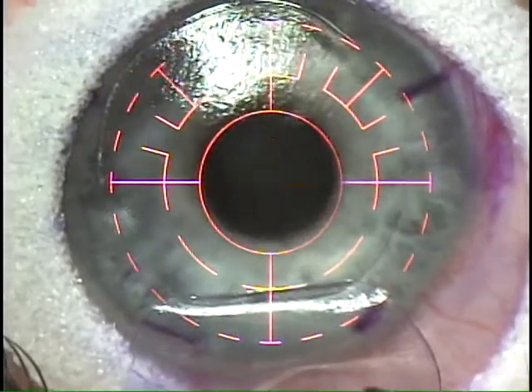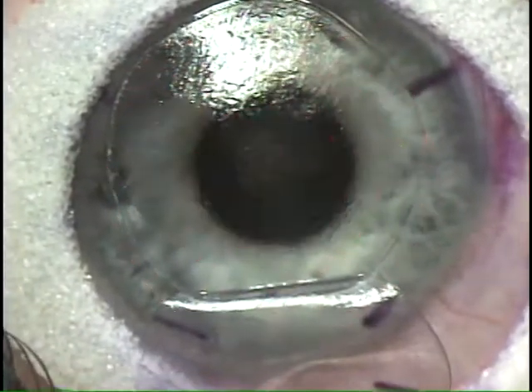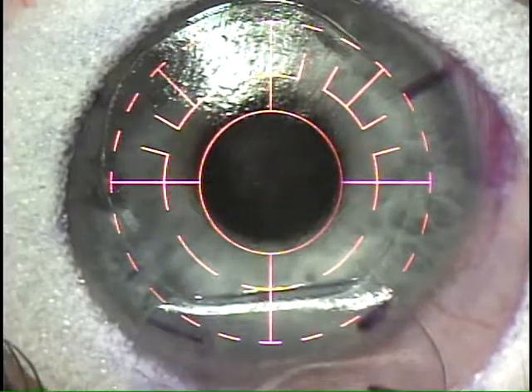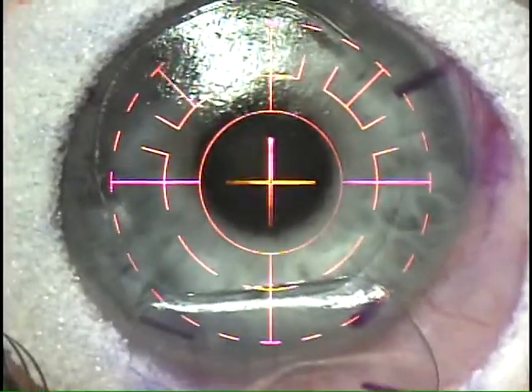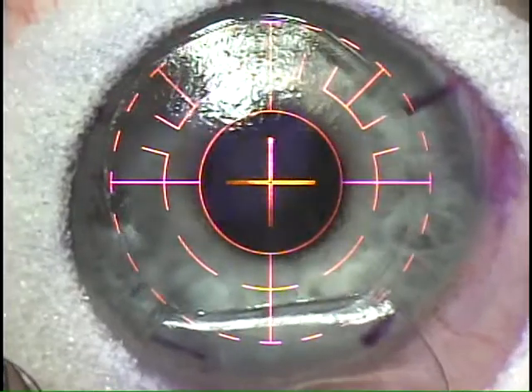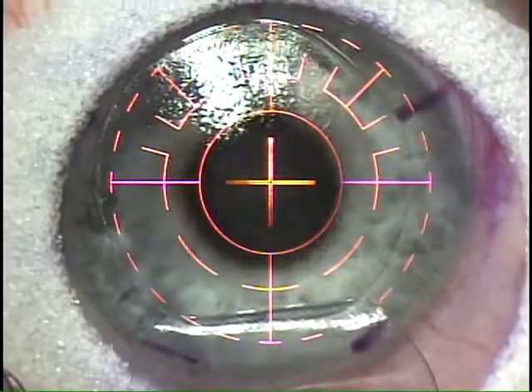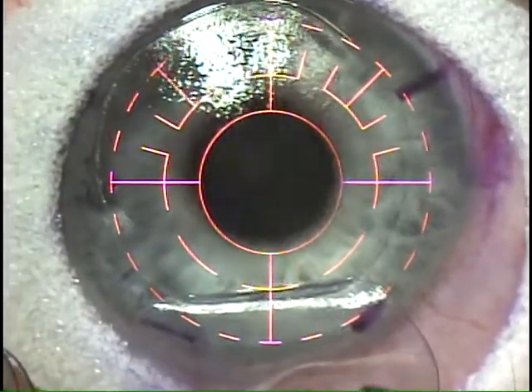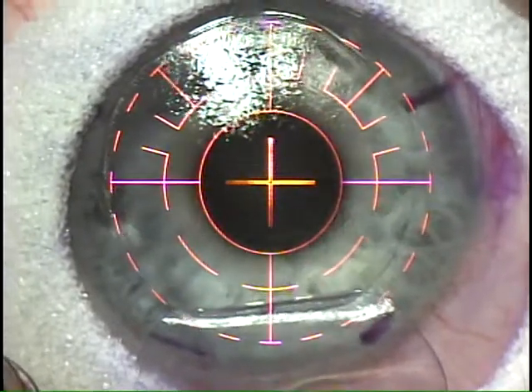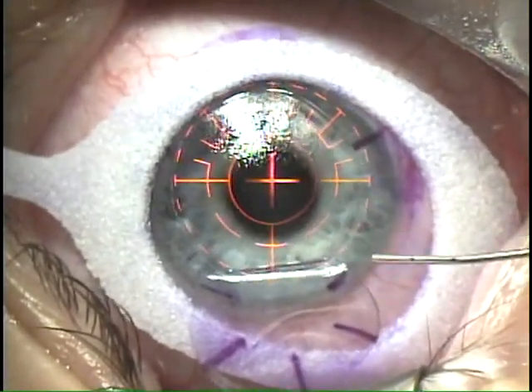We've got 21 seconds. Okay, we're going to tone it down just a little bit more. You okay, Ben? Yeah. All right, there we go. Here we go. Very good. Well done, Ben.